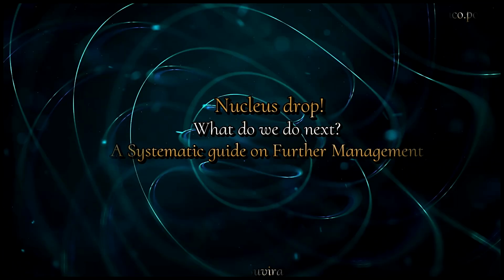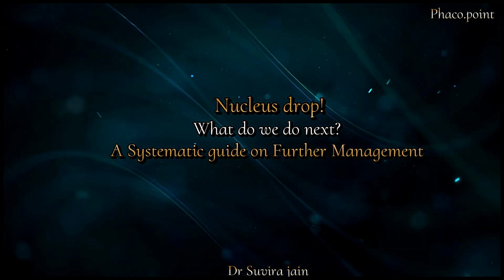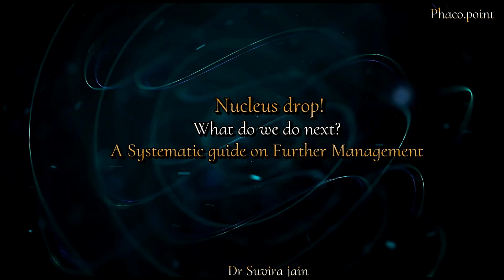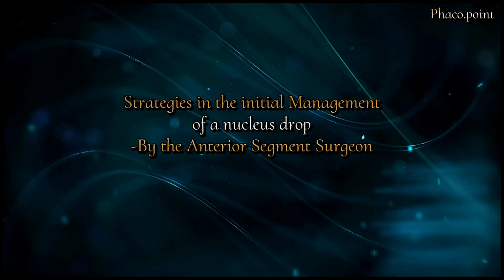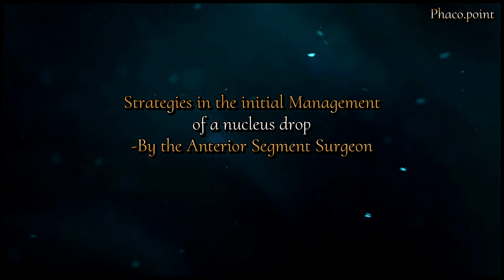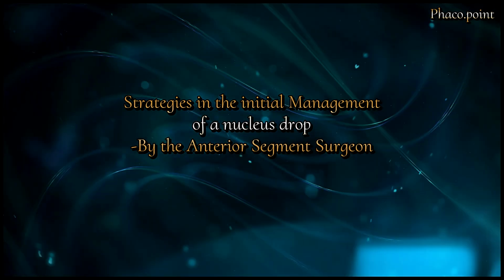A nucleus drop during phacoemulsification is perhaps one of the most devastating complications that we may face while performing a phaco. There has to be an understanding of how we should approach the case once we've had a nucleus drop prior to handing the case over to our vitreoretinal colleagues.